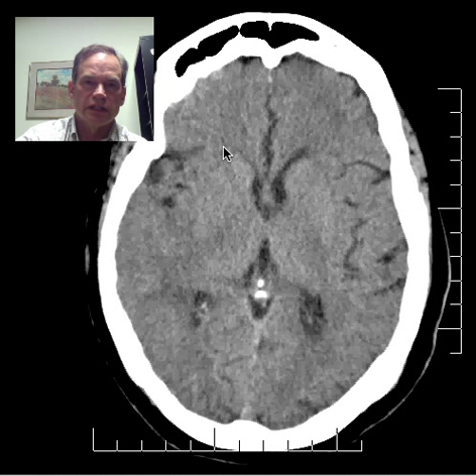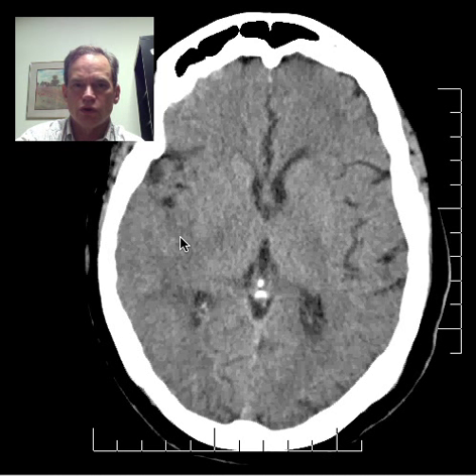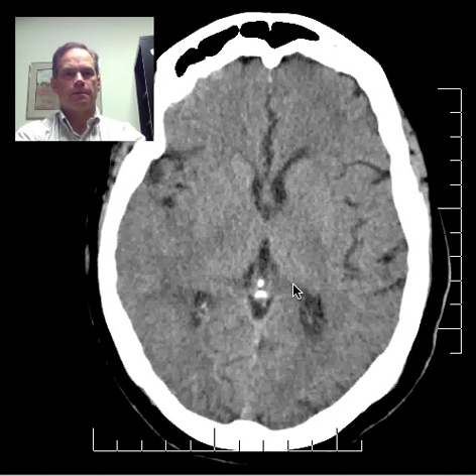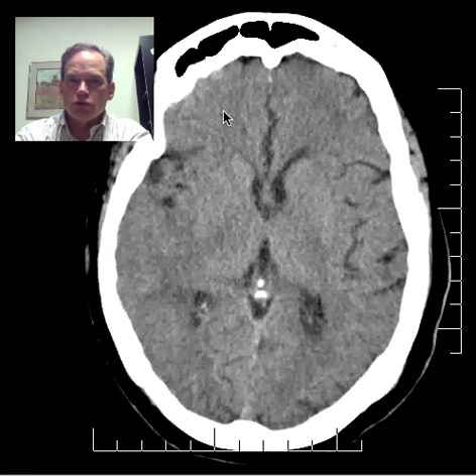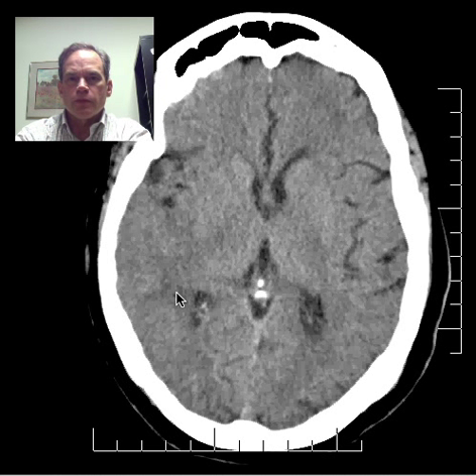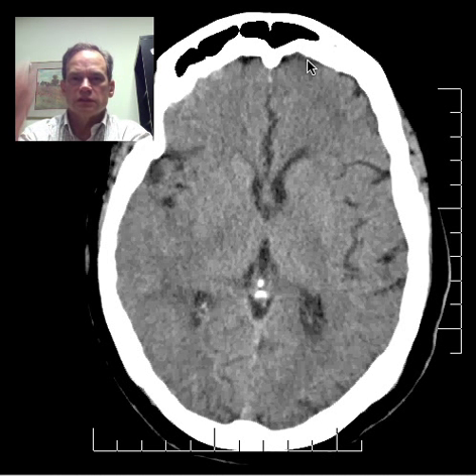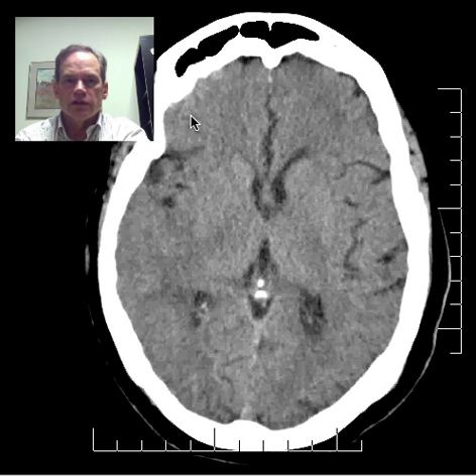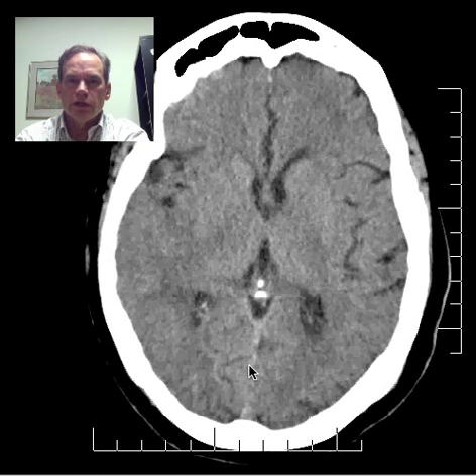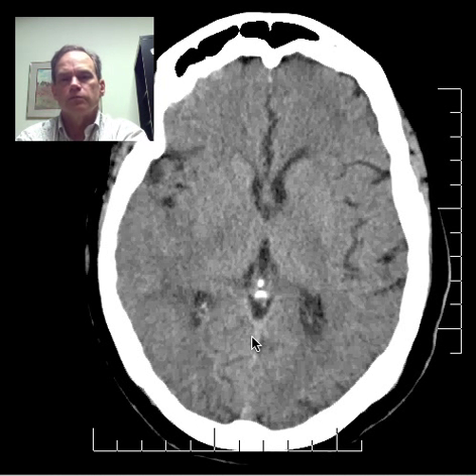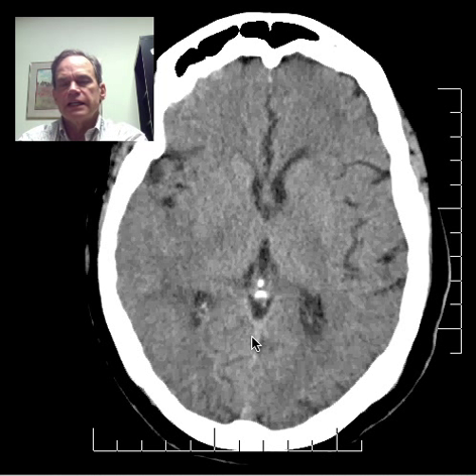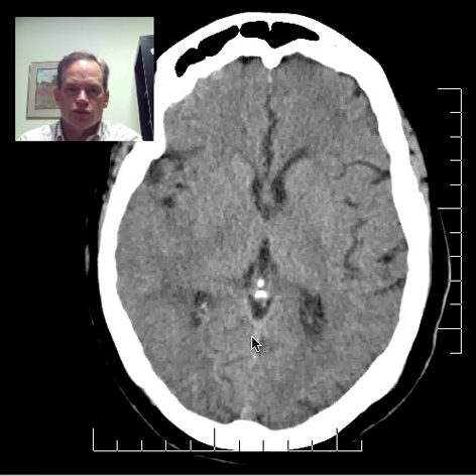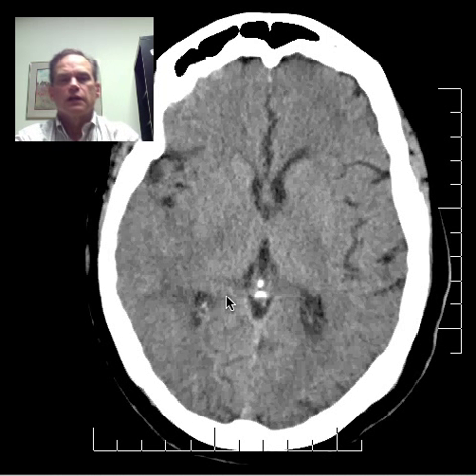Gray-white matter differentiation is pretty well seen on this side, but here it's quite indistinct — ill-defined and not visible around here. This is a stroke. The anterior cerebral arteries supply this area at the top of the brain, the right middle cerebral artery territory is here, and the posterior cerebral artery territory is here. The distribution varies at different levels of the brain.